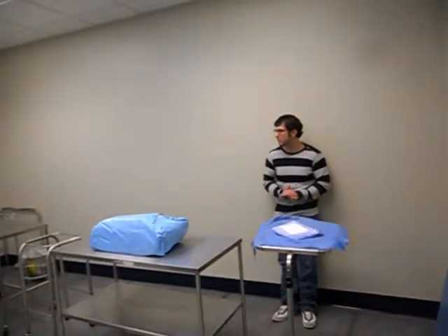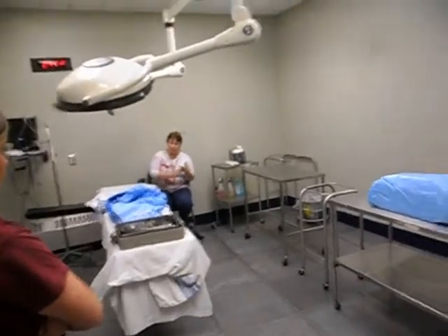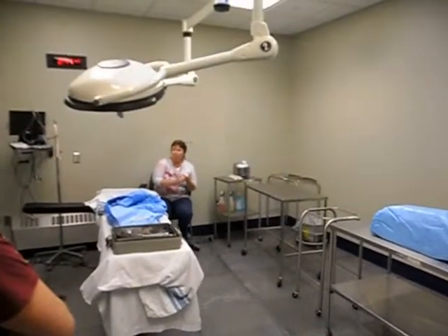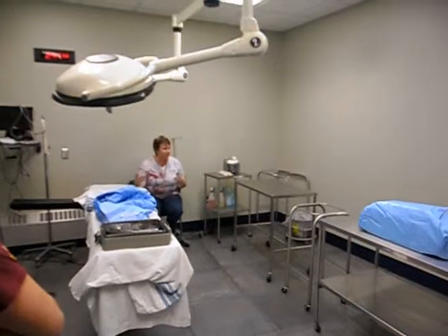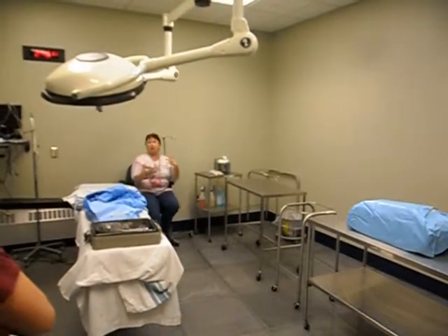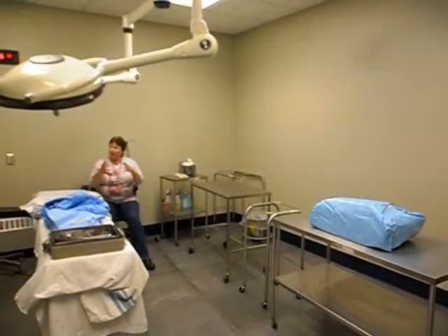Right, that changes it. So if you used a knife on the intestines, on the bowel at all, you would need to not use that knife again. But how about clamps? You now want to be looking at bowel clamps, things like that. If we were doing an aneurysm, we want things like our DeBakey's and Cooley's and Satinskys, and we want vascular things. So if we were doing a hysterectomy, now we're going down the Heaney world, and Rogers and Mastersons and clamps that are used in GYN surgery, some of which you haven't seen in the ones that I just named. So that's what's going to change.